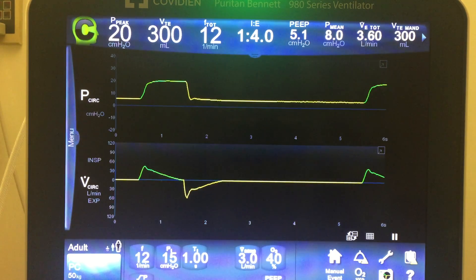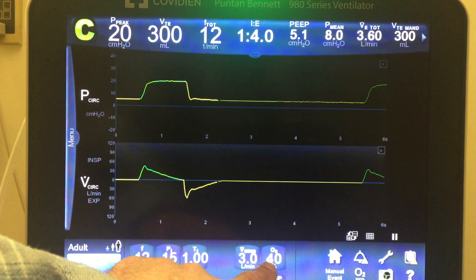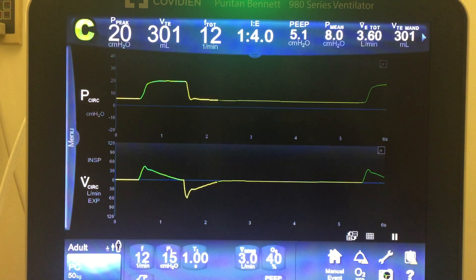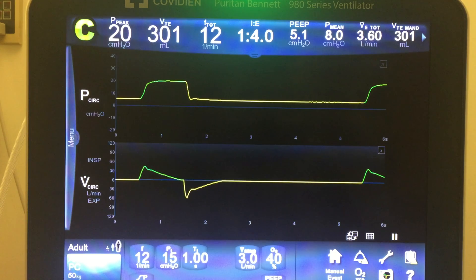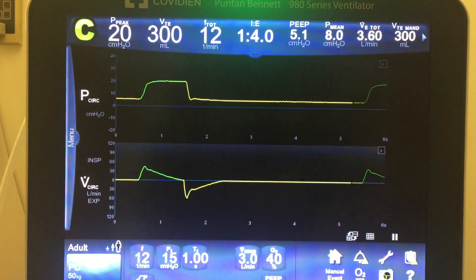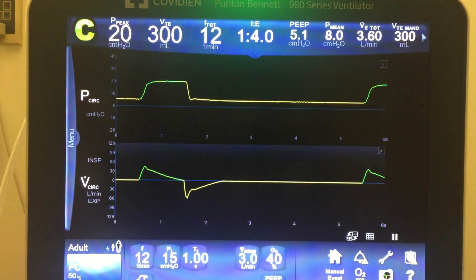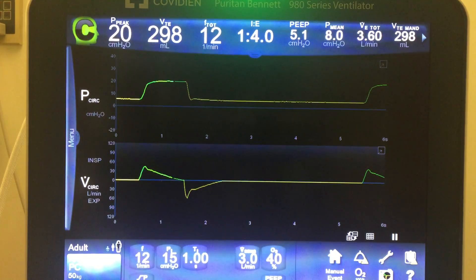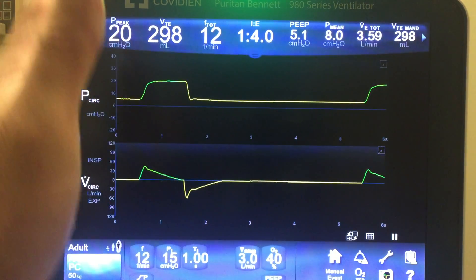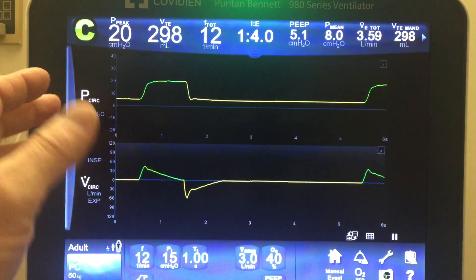Our next advantage to pressure control is oxygenation. If we want to oxygenate a patient, there are two ways we can do it — we can either put more oxygen molecules into the patient, thus the FiO2, or we can hold pressure to the ones that are in there. Anytime we pressurize the lung, we're going to have oxygenation. Not to mention the fact that if you hold pressure in the lungs, you're going to get alveolar recruitment, which is also another advantage to pressure control. This test lung doesn't have a lot of resistance to it, so it's going to be hard to mimic this. I'll do a piece at the end that mimics this better, but I'll talk through it right now — this idea of holding the pressure in there for alveolar recruitment and oxygenation.